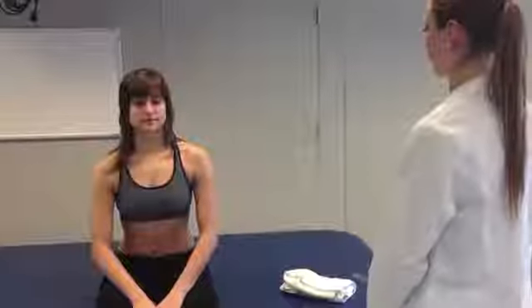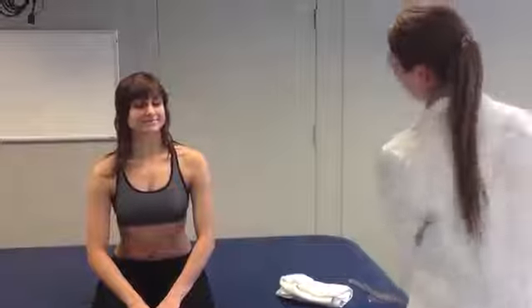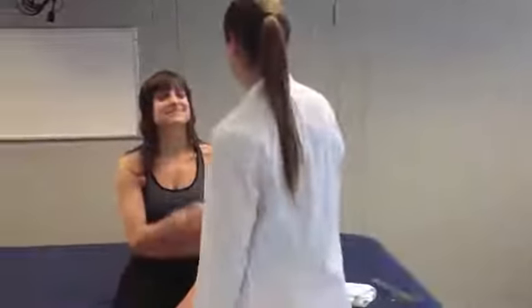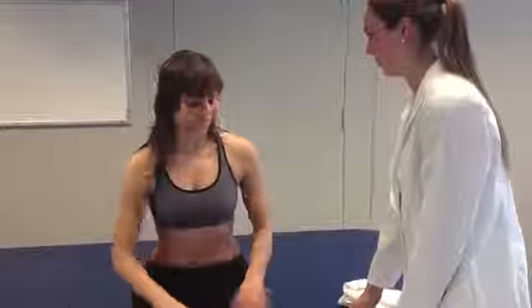Next, we will demonstrate measuring shoulder external rotation with proper patient interaction in the clinical setting. Begin the session by introducing yourself to the patient and washing hands. Hi Kat, my name is Betsy Webb and I'm going to be your therapist today. Nice to meet you. Now explain the test to the patient using patient-friendly language. So today I want to measure external rotation of your shoulder. So that's the motion when you go from inside out towards the walls. Okay. So if you can, I'm going to ask you to lay face down on the table. Okay.